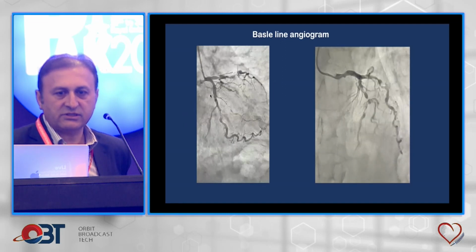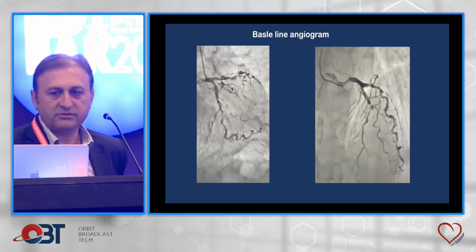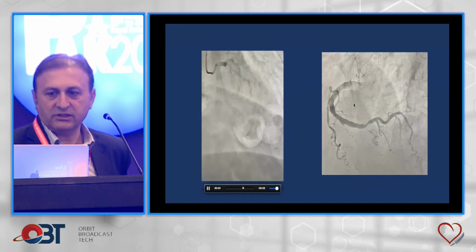This was her left system, and this was her RCA.